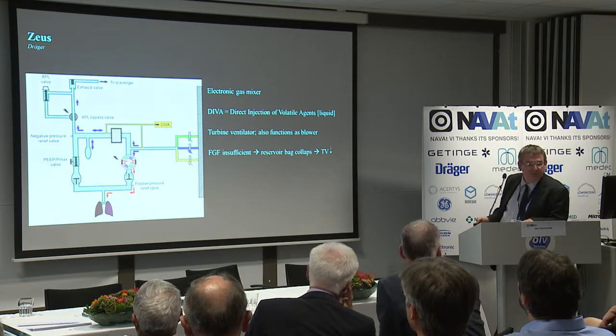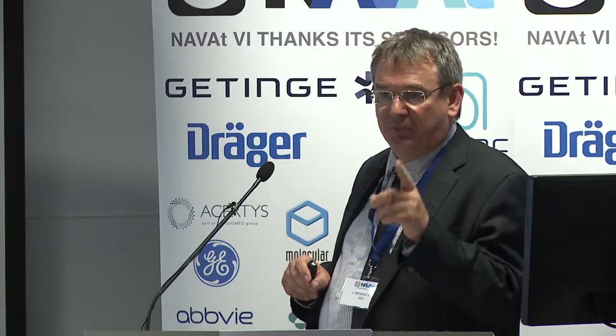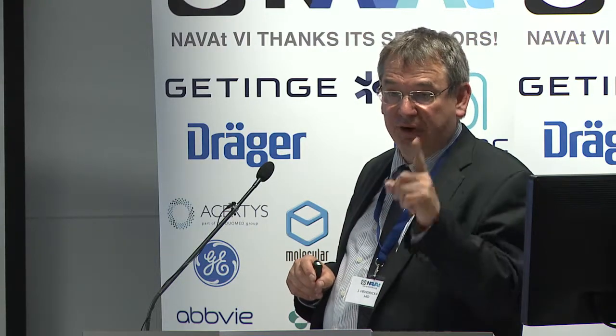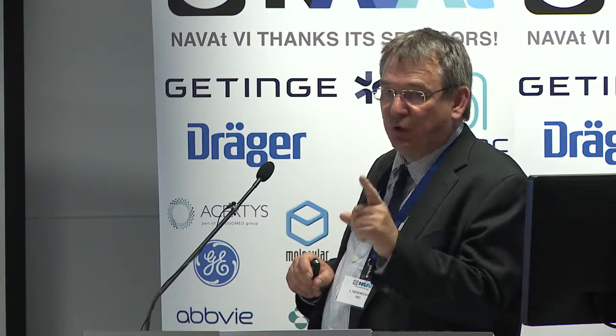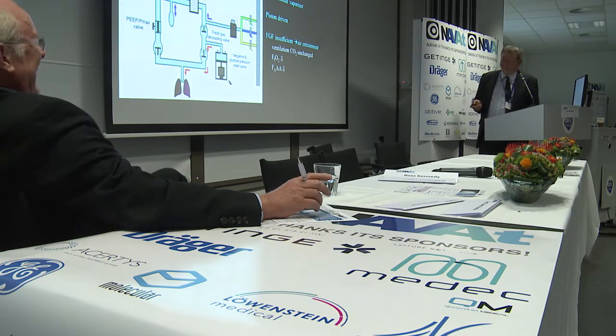And then we have one comment to this. Yes, go ahead. And of course the bag first collapses. Yes. And then only if the ventilator is not able to ventilate, an alarm appears and air is entrained. I forgot to mention this. This presentation ignores the alarms that will be going off in the different anesthesia machines. Very important. So if I were ignoring the alarms that would go off, then what would happen? Very good point. I told myself I should say this, but I forgot, so thank you for bringing that up. Absolutely right. You are listening carefully.